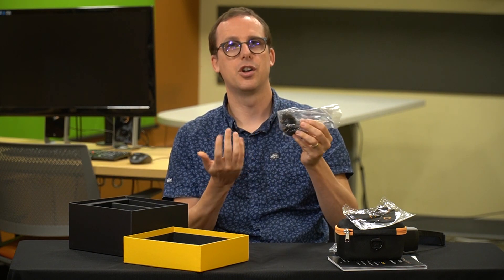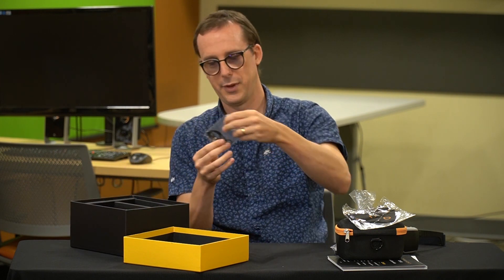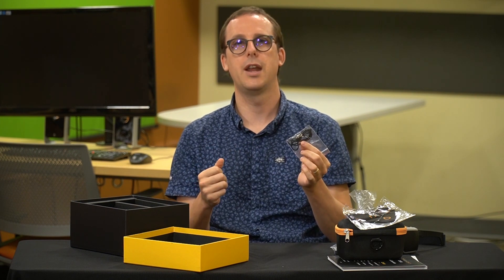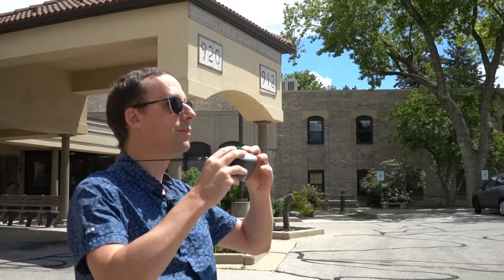Next, we have some charging apparatus for if you go to other countries, which hopefully you will get to enjoy. And finally, we have a lanyard. This is actually kind of important for the Onix because it will allow us to hang it around our neck as we're walking, and then we can use it almost as a pair of electronic binoculars — we'll be taking a look at that in just a little bit.